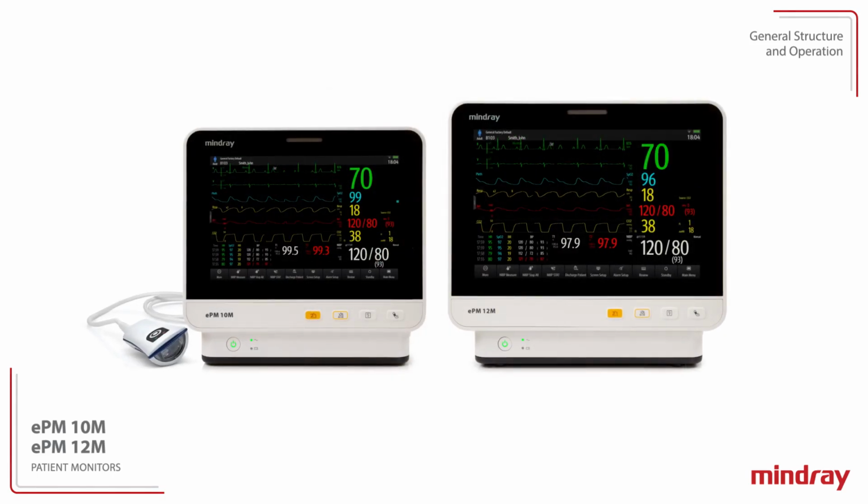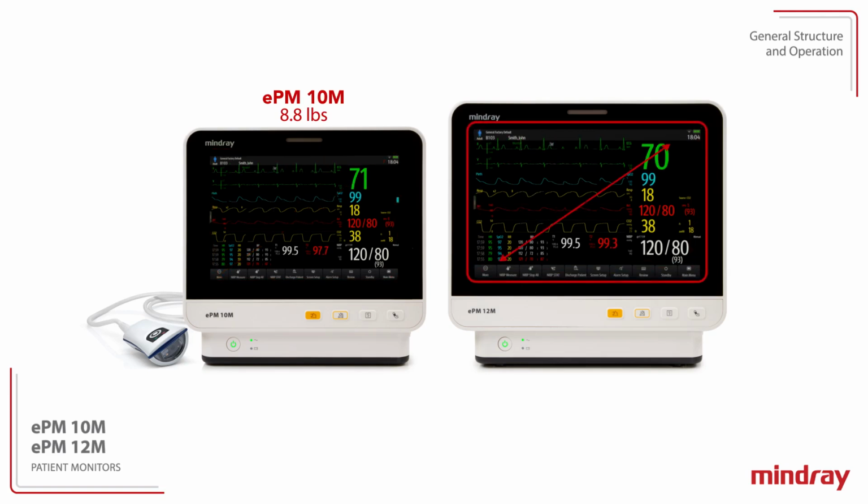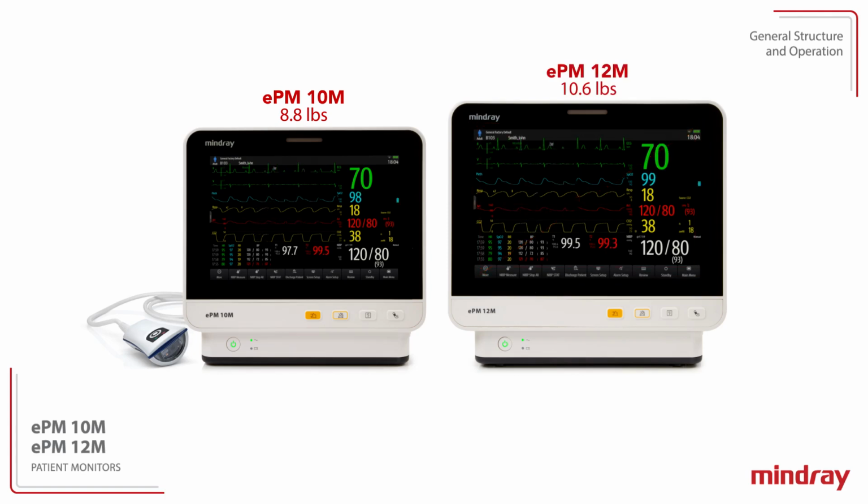The ePM 10M and 12M patient monitors feature an intuitive user interface through a multi-gesture capacitive touchscreen. The ePM 10M patient monitor has a 10-inch display and weighs approximately 8.8 pounds. The ePM 12M patient monitor has a 12-inch display and weighs approximately 10.6 pounds.